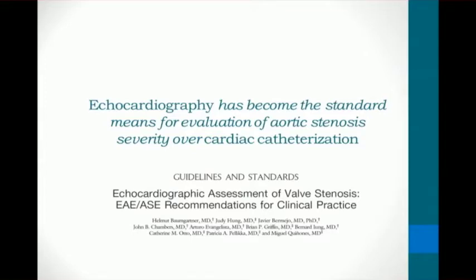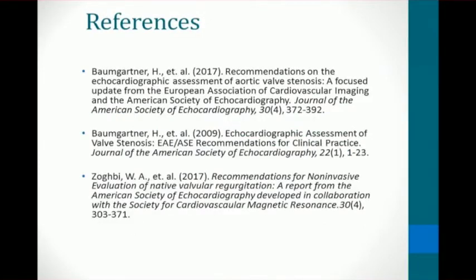Lastly, I wanted to emphasize the importance of the echo exam to properly interrogate aortic stenosis. Echo is the standard for aortic stenosis evaluation over cardiac cath. Therefore, we play a major role in deciding if these patients go to surgery.